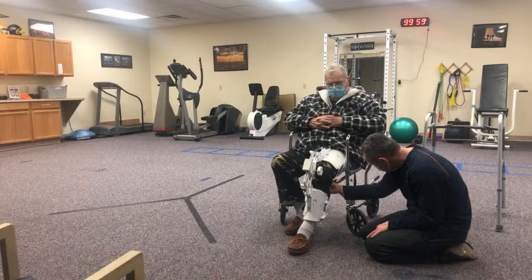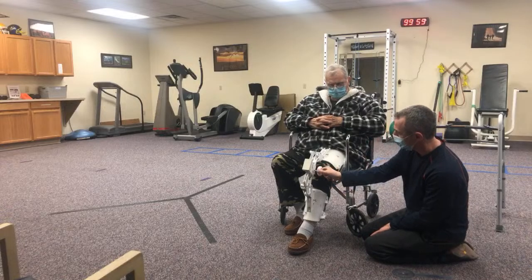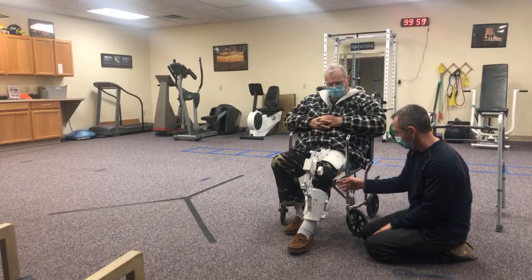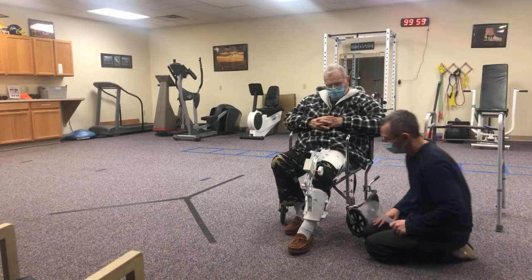It's comfortable, okay. I'm going to give it just a little more and then let it just stay like that.